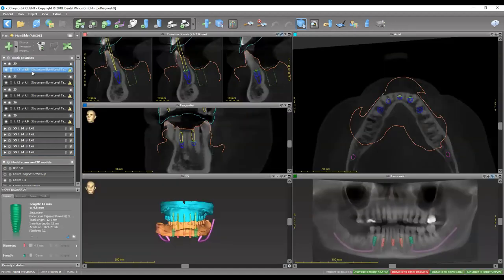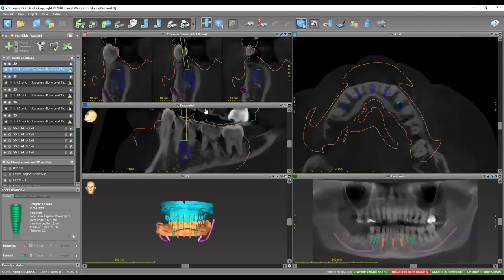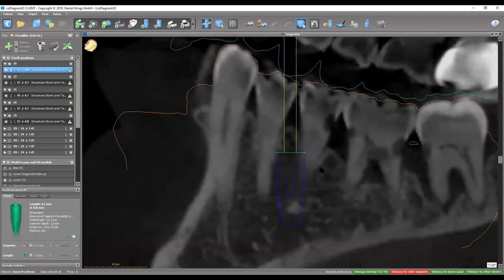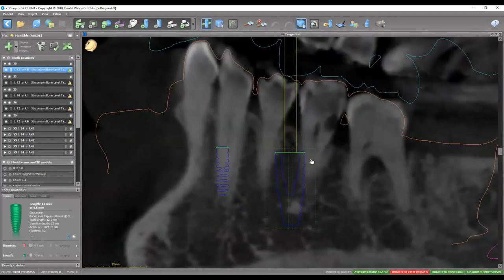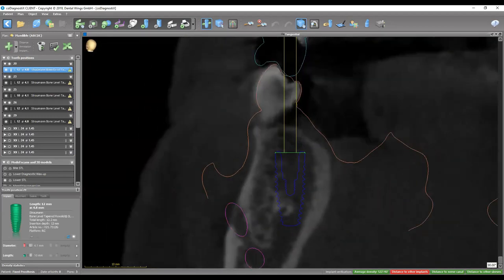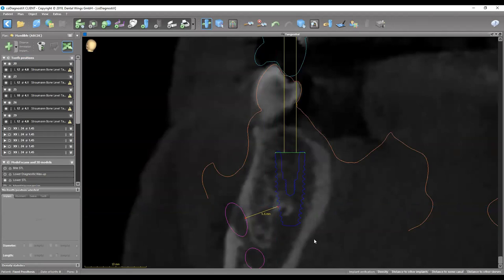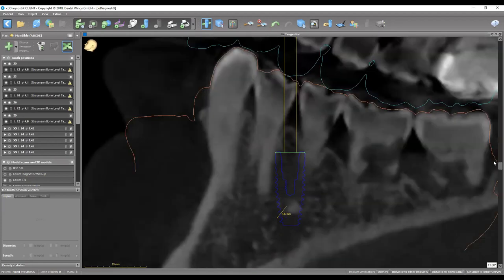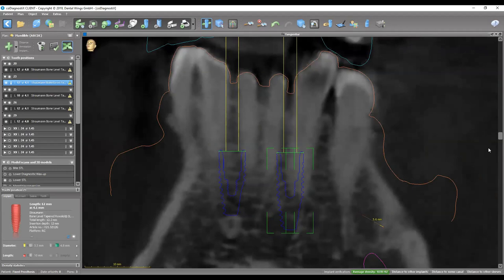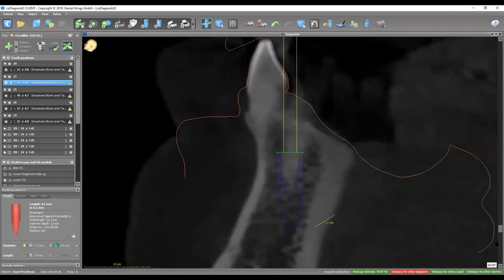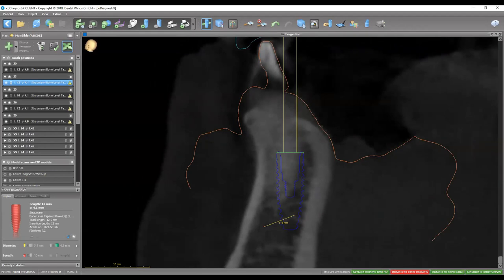We'll check how those implants look from the cross-sectional view. Starting with the one on the left side, number 20 — placed between the sockets of both the first and second bicuspids. From the cross section it looks really good — the center of the implant is emerging towards the functional cusp of the opposing dentition. We're clear at more than three to four millimeters away from the nerve, around five-and-a-half millimeters, with good distance from the lingual plate. Moving to site D — a 4.1 by 12 — bone support is more than two millimeters on both sides, emerging out of the cingulum.